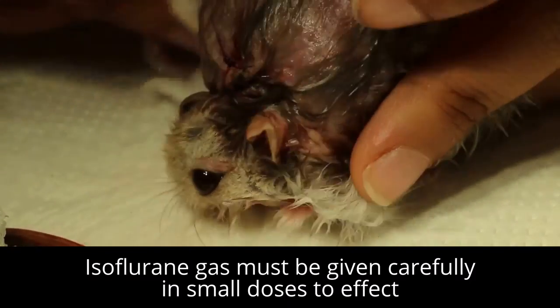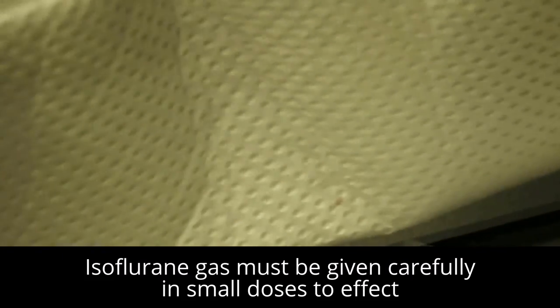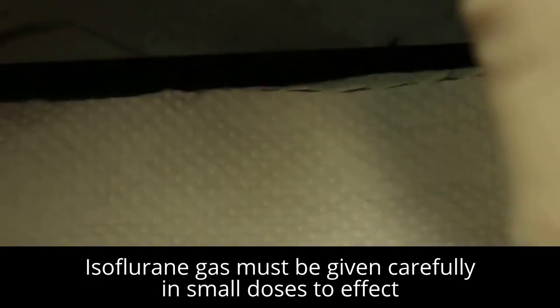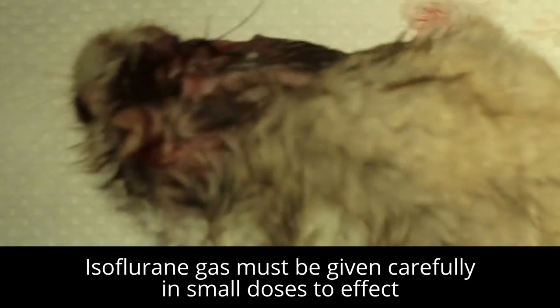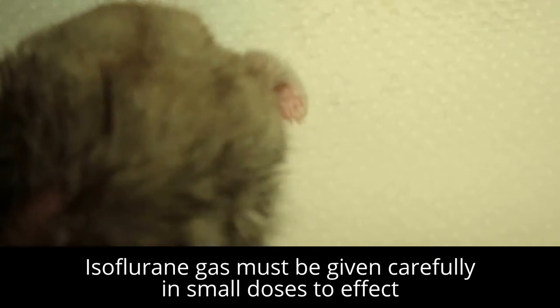Okay, no more blood, then put it in. Be careful if the hamster will bite you. Okay, put it in. So then we wake up already, he's waking up soon. And okay, we switch off the gas so that it's the end of surgery. Then this is the lump, just show the lump.